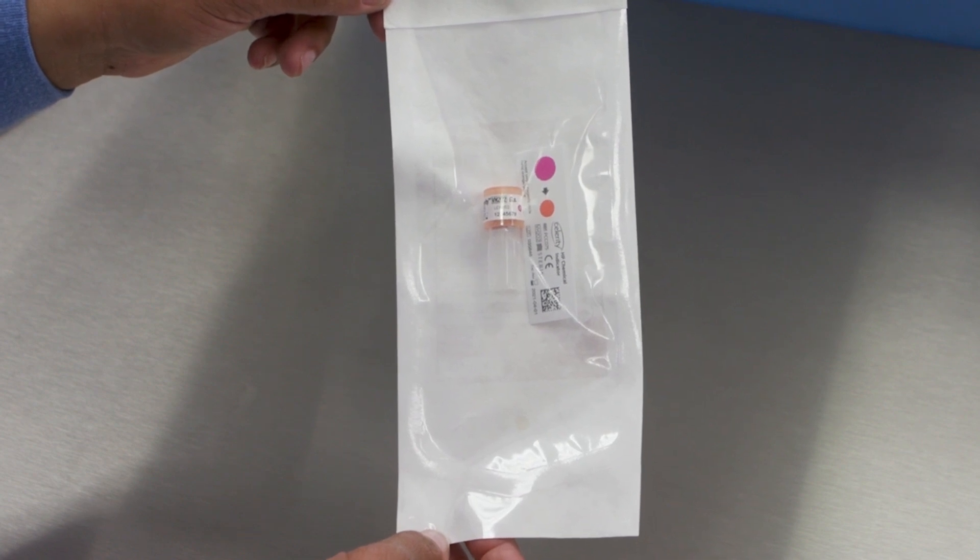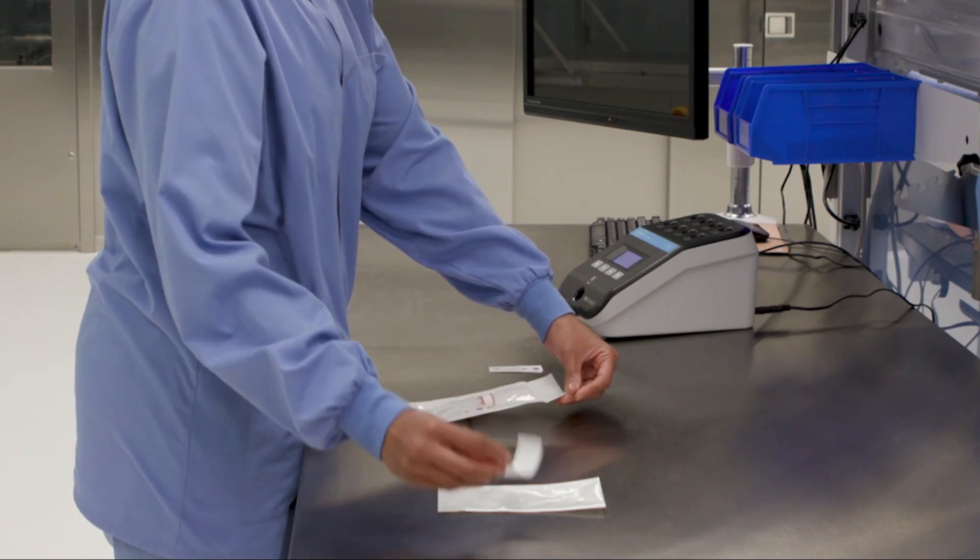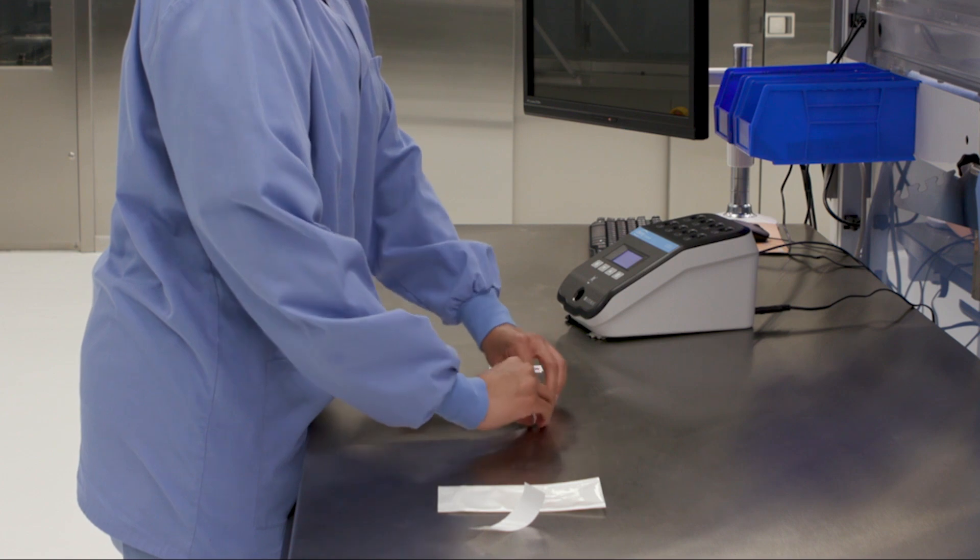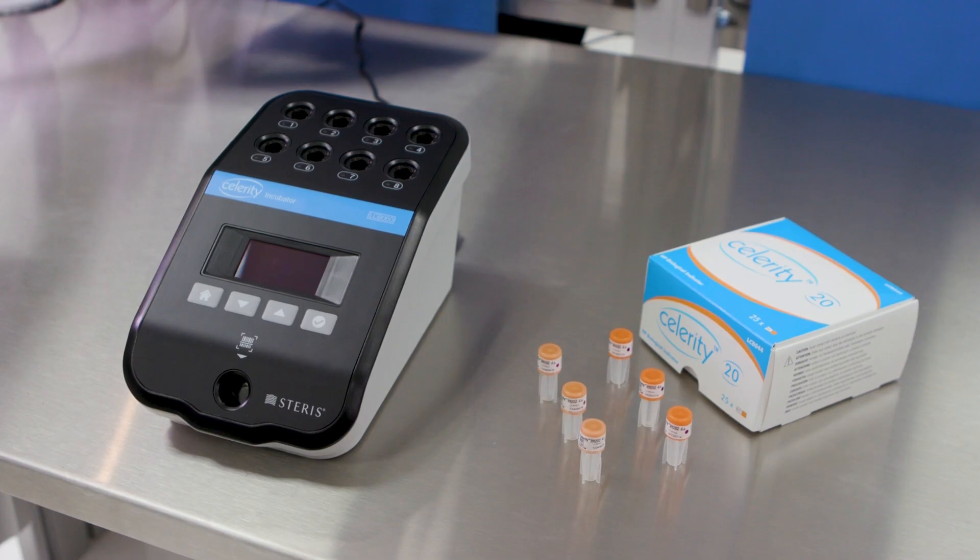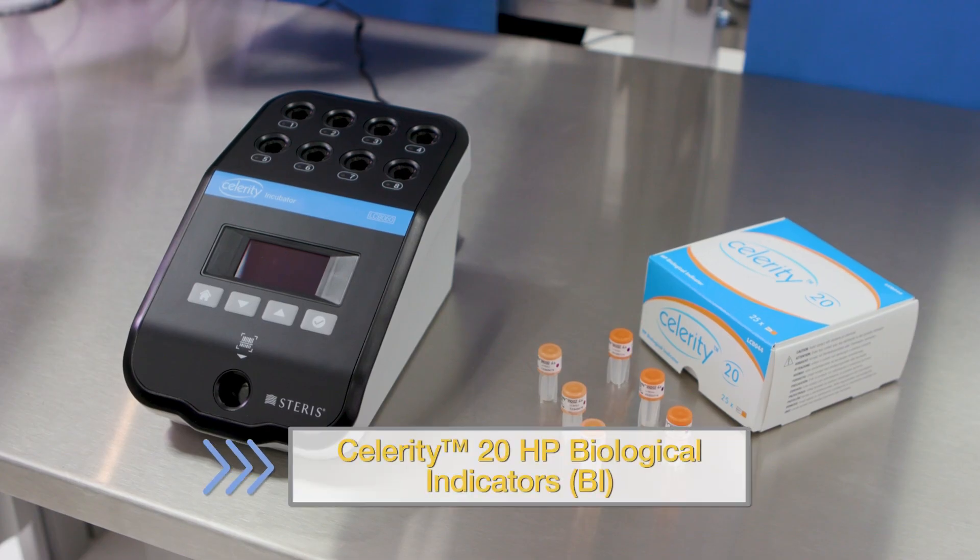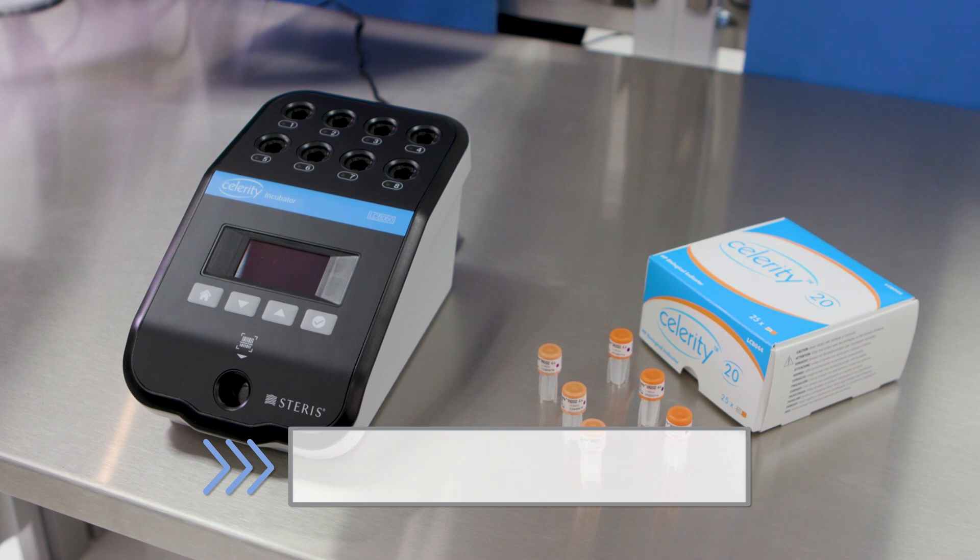The Celerity HP BIs are used for monitoring VPRO low-temperature sterilizers and STERAD systems. Materials needed include Celerity 20 HP biological indicator or Celerity 5 HP biological indicator to perform the test.